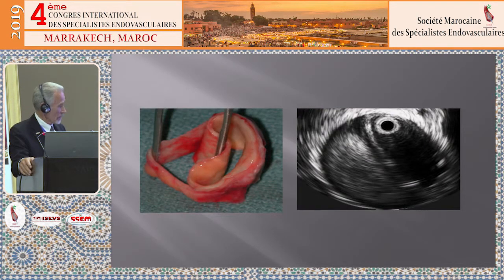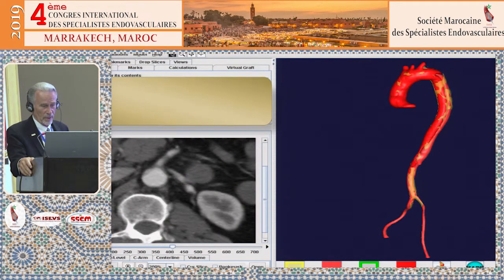The dissection, I think, as everybody is familiar with, this is from a patient in the ascending aorta, where you can see where the entry point, then this why the outside layer, which is very weak, dilates. This is an ultrasound image, and we'll see some in a little while of how we characterize these, the true lumen, the false lumen, and also you can, with the grayscale, quantitate the flow after you've covered an entry tear.